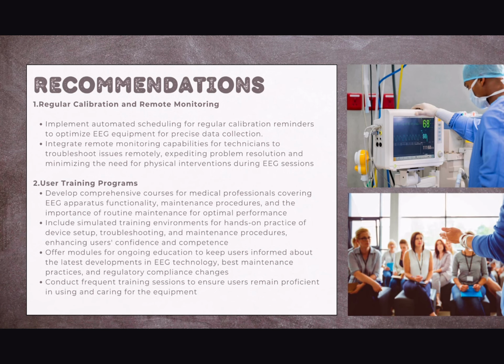Recommendation 1. Regular calibration and remote monitoring. Implement automated calibration reminders to optimize EEG equipment and integrate remote monitoring for quicker issue resolution during sessions.